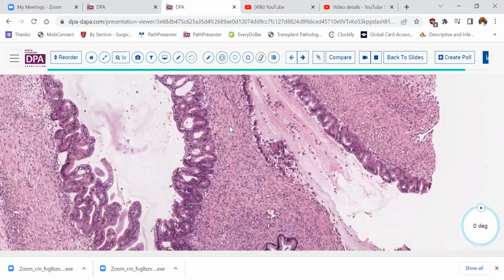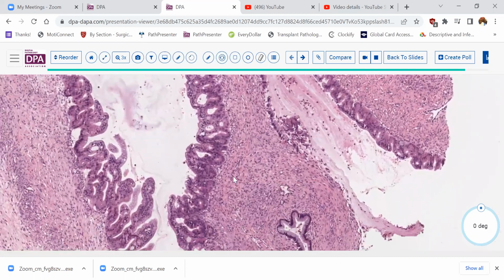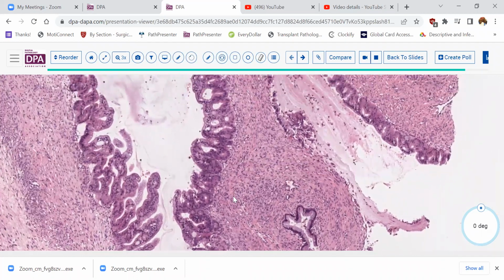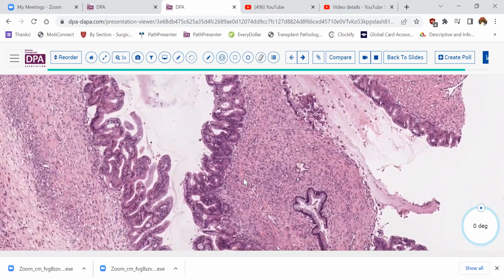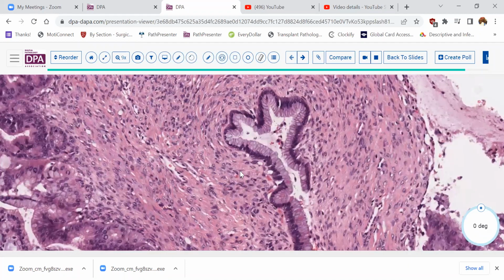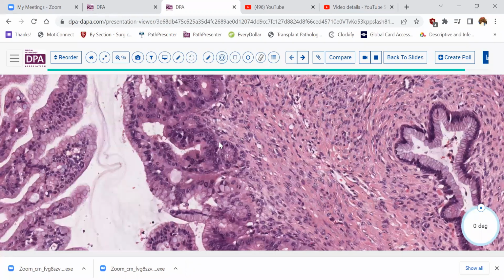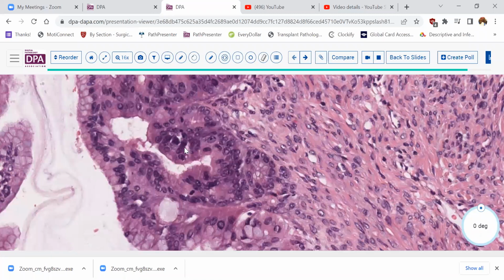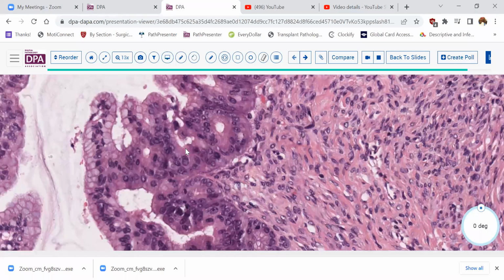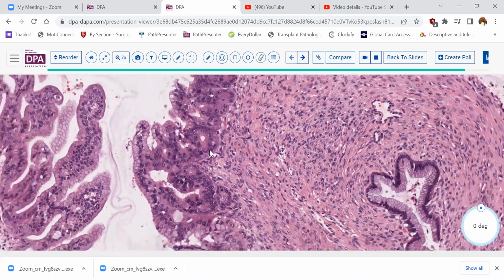For me, the differentiation between a mucinous cystadenoma and a borderline tumor is primarily cytologic. So you can get sometimes complexity with areas like this, but unless you have significant nuclear hyperchromasia or atypia beginning to form, and that's often characterized by sort of a rounding up of the nuclei, then that is the feature that I look for to say, well, this very likely could be a borderline tumor.